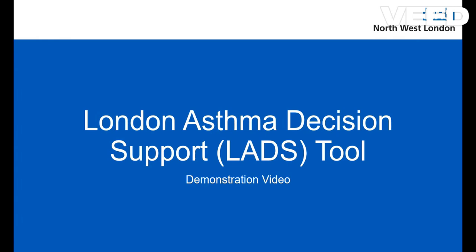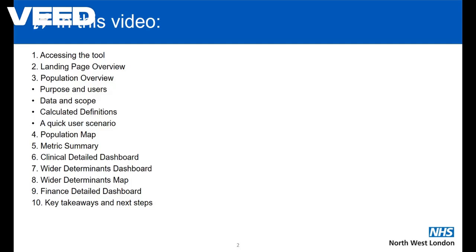Welcome to the London Asthma Decision Support Tool demonstration. Here is what we will cover today, briefly. The structure and timestamps available in the video description help you jump to any section in the video.